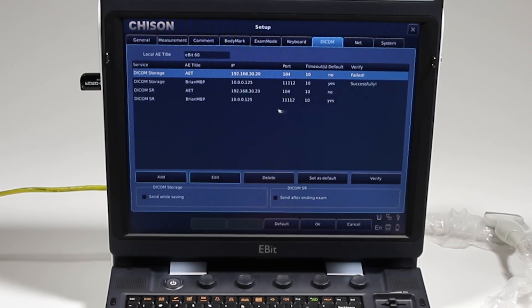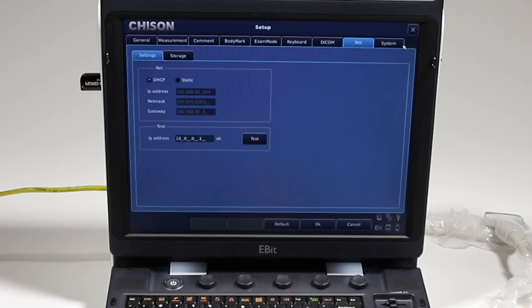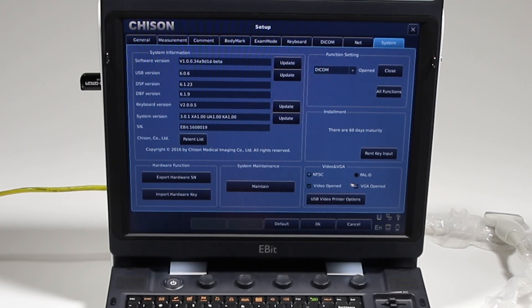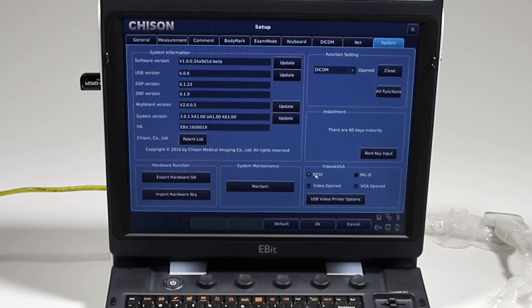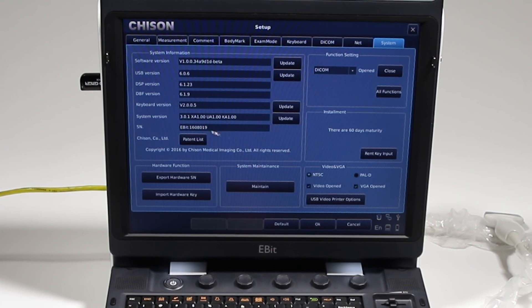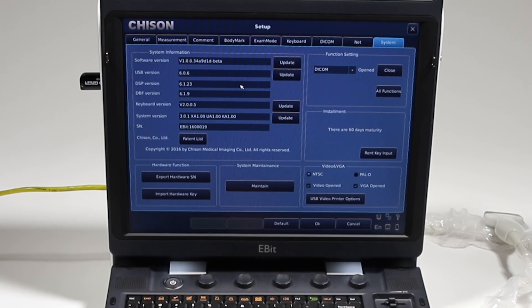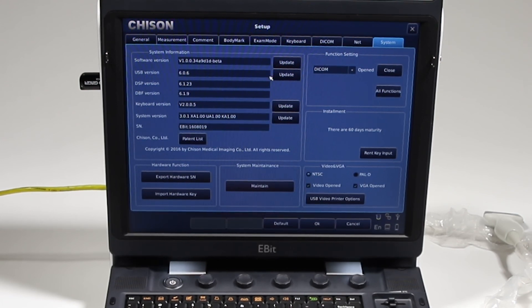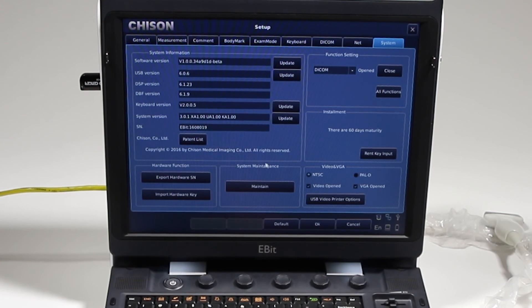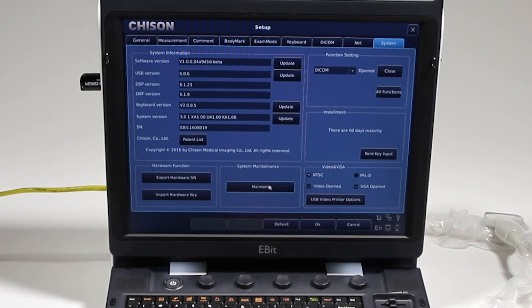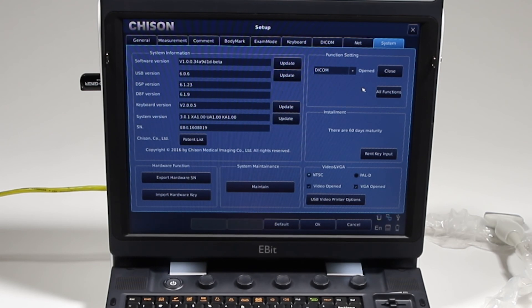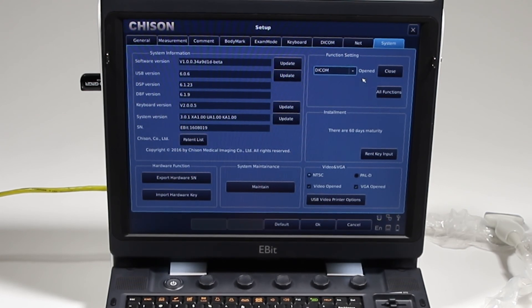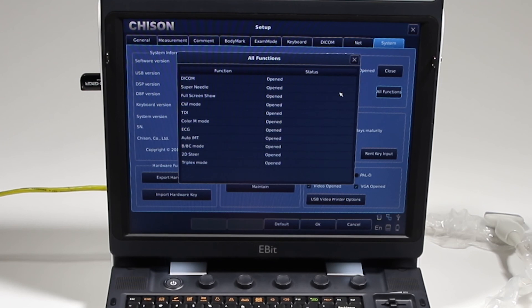So I'll go back to that menu. We have our network, the DICOM setup, the system. This is where you're going to get various system information. Video output: how do you want it to show up if you have the output attached for a video monitor? When you have any updates, this is the screen you'll come to. You'll download it to a USB disk. We'll give you instructions, and you're just going to simply click update and it will do it for you. It's pretty simple. So all this, there's system maintenance that you might want to go through from time to time. And here it's going to show you all the functions that you have added to your machine that'll tell you various items.